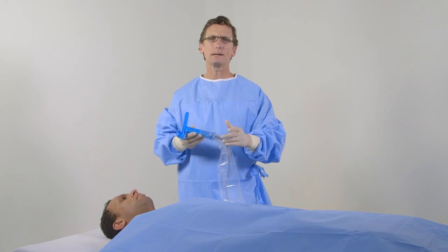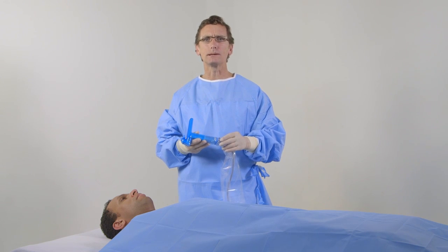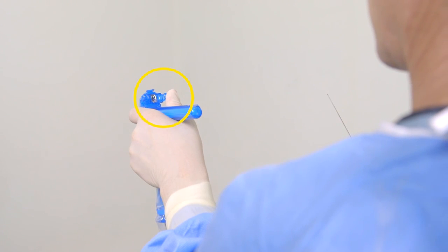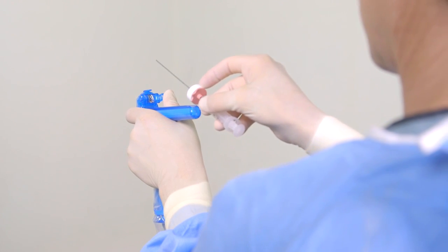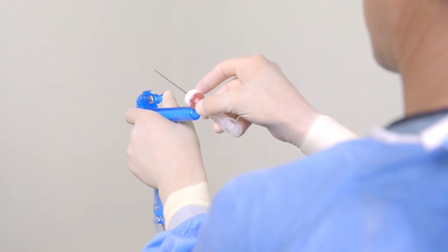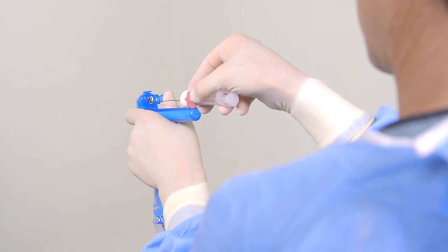To begin a procedure, assemble the transducer and sterile shield from the AxoTrack 1 procedure kit and preload the needle into the integral needle guide. Start preloading the needle by rotating the needle clamp fully forward with your thumb to the open position such that the needle guide opening is unobstructed. Then, place the magnet against the proximal end of the magnet rail to stabilize the needle as you move the needle tip into alignment with the needle guide opening.